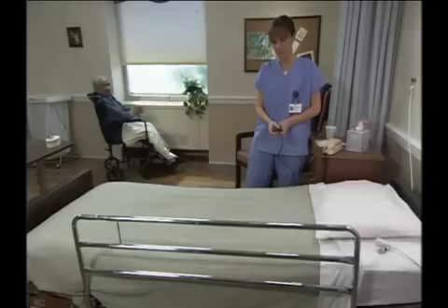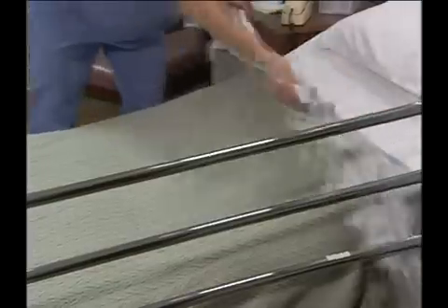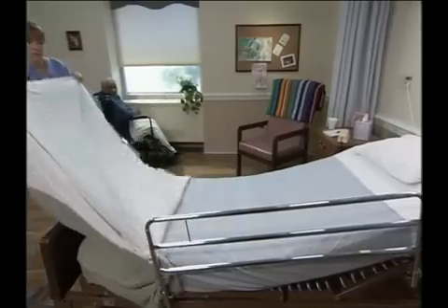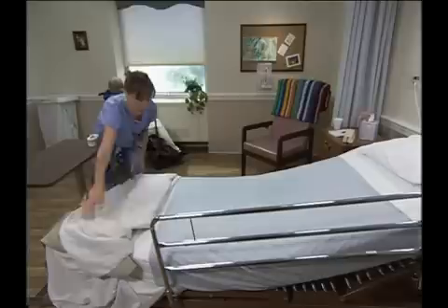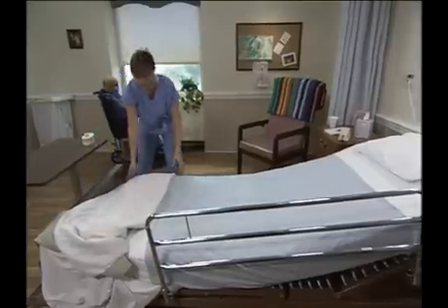Then, raise the head of the bed. Fan fold the top linens to the foot of the bed. Then, make sure the side rail on the working side of the bed is down, while leaving the opposite rail up. Now you are ready to position the wheelchair.